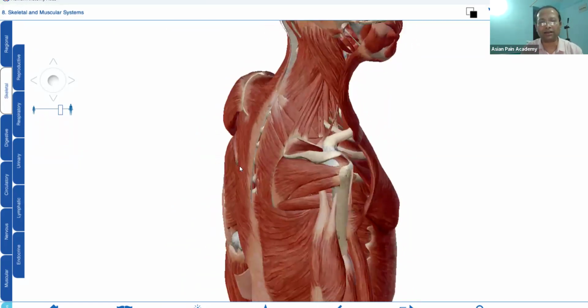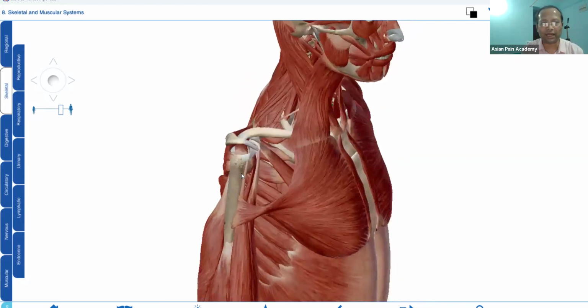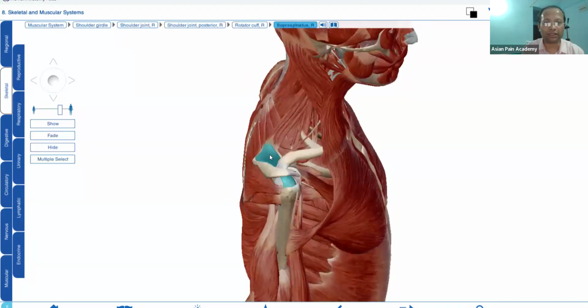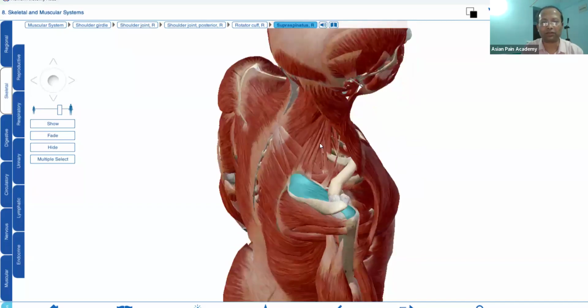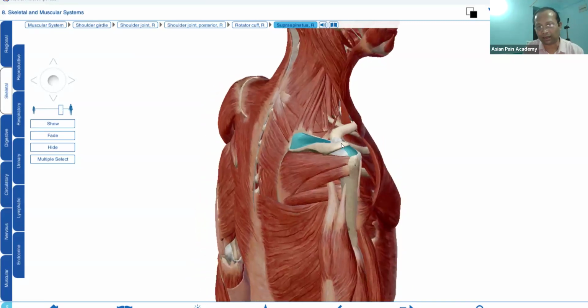So what are the other muscles? Now, second group of muscle. Okay, see carefully. Second group of muscle, one muscle is this one and one muscle is this one. So this is the most important muscle, that is supraspinatus muscle. You see, this is the supraspinatus muscle. So this is just under the trapezius in this area when it has not crossed the acromion. But when we see lateral to the acromion, this is under the deltoid. Okay, so this is second layer.